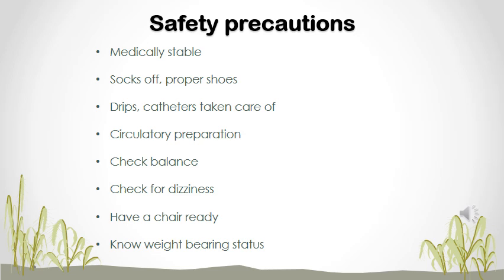Socks should be off, proper shoes on. Drips, catheters, you should take care of them while walking if they are still in situ. You will have to help to carry or push the drip stand, or take the drip bag off and securely walk with that as well as the catheter.